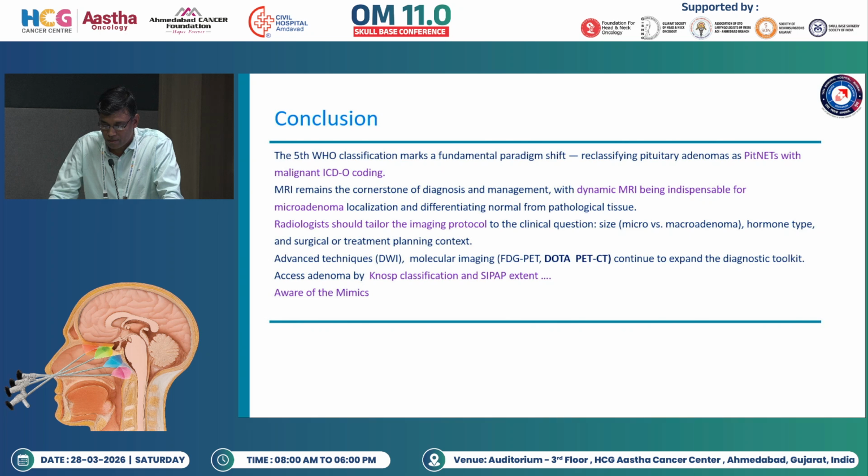Just to conclude, there has been a shift in classifying pituitary adenomas. Now they are called PitNETs, and from a benign entity they have been moved into the malignant coding disease management group. And dynamic MRI is indispensable, especially for microadenoma localization and differentiating it from various other pathologies. Radiologists should tailor the imaging protocol, whether it's for micro, macro or follow-up, and then they will decide what is happening to these patients.